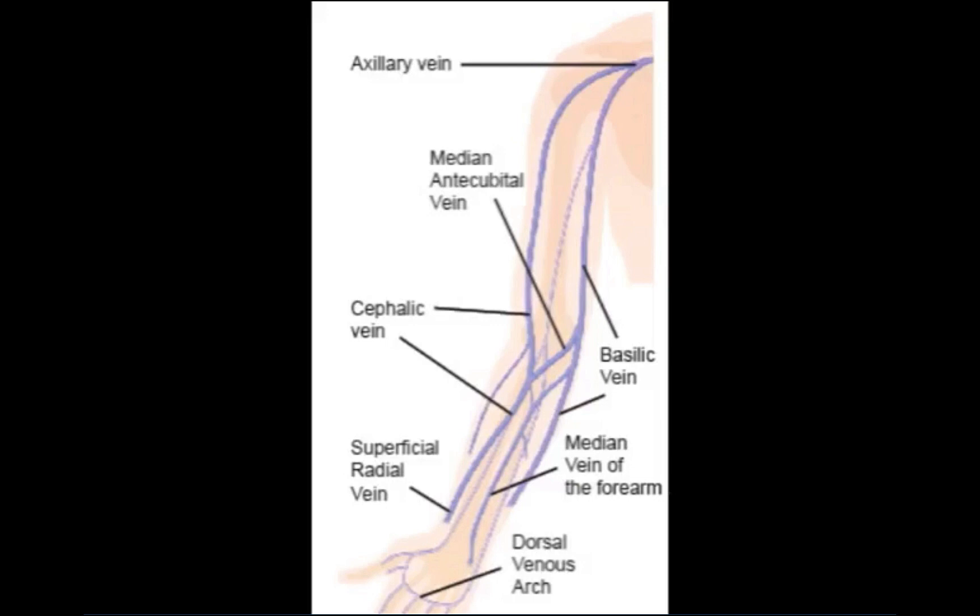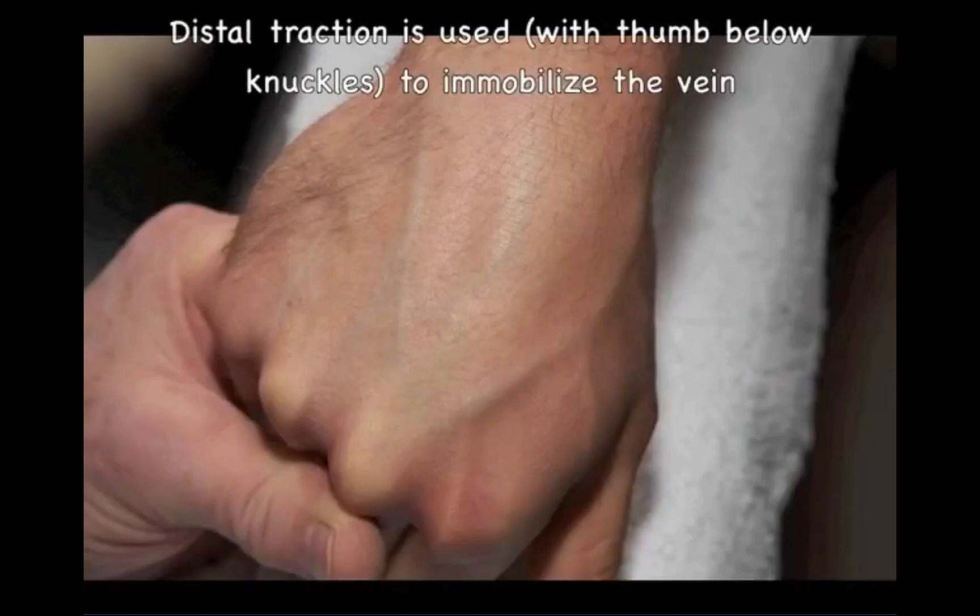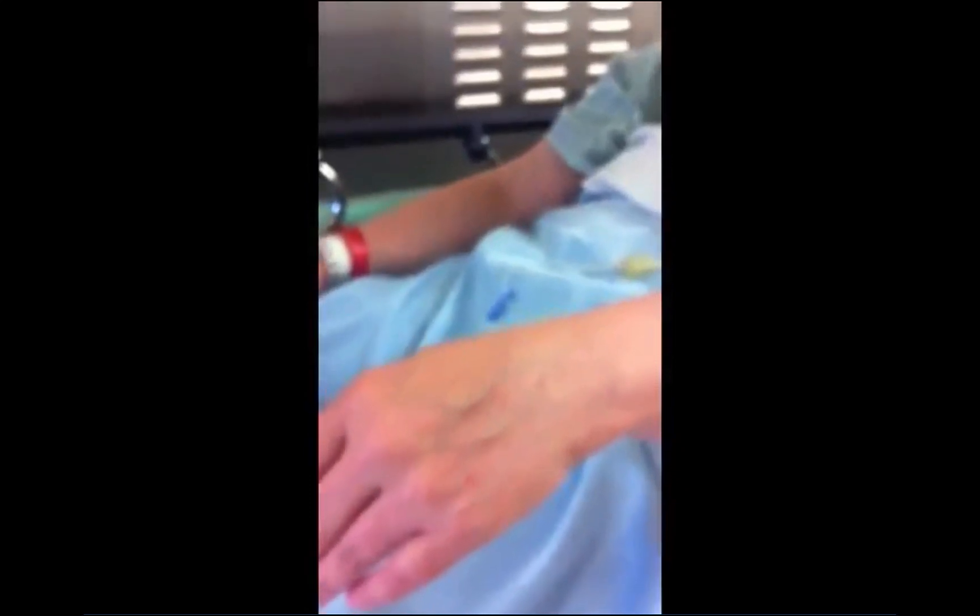The cephalic, basilic, and median vein of the forearm are very superficial and can be accessed in the forearm. Intravenous access in the forearm gives the patient the greatest degree of freedom of movement after surgery and is an ideal location for prolonged IV access. Superficial veins on the dorsum of the hand are also readily accessed and commonly used for short-term venous access. After applying a tourniquet, gently tap the vein to promote venous dilation and select an appropriate entry site. Avoid slapping the vein, as this can be uncomfortable and anxiety-provoking for the patient.